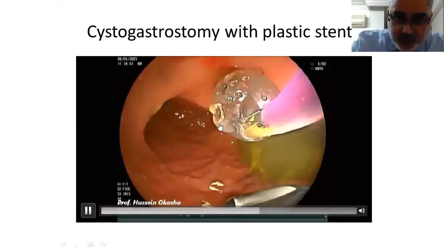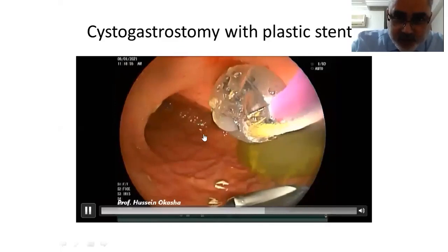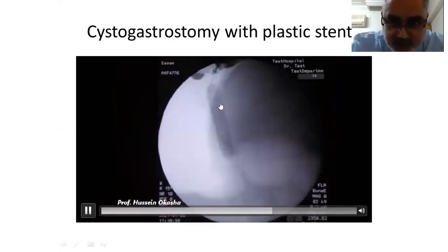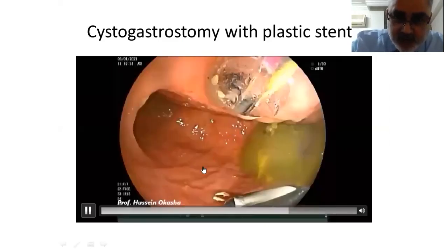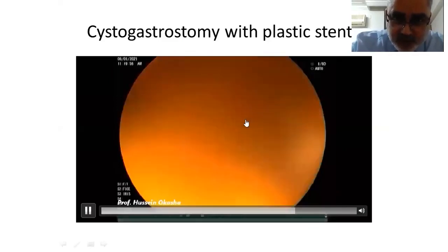And by the radiological screen, the fluoroscopic screen, we can see obliteration of the waist. Here, there is some indentation of the balloon. So the waist is there, and then we keep inflating till the waist disappears. Then we ensure complete inflation, and then we deflate the balloon.